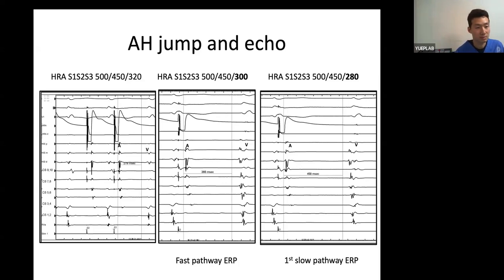Second, the ostium tended to be much larger. So maybe just putting one diagnostic catheter in the CS may not be enough. That's why in Jackman's lab, they invariably put 2 catheters, or even 3 sometimes, to see those areas, for pacing purposes, for confirmation purposes, and many other reasons.